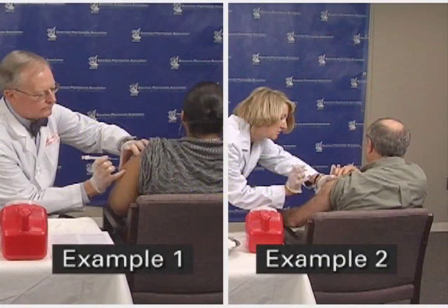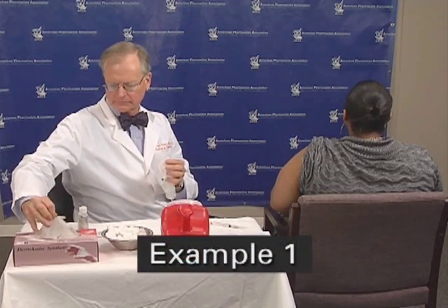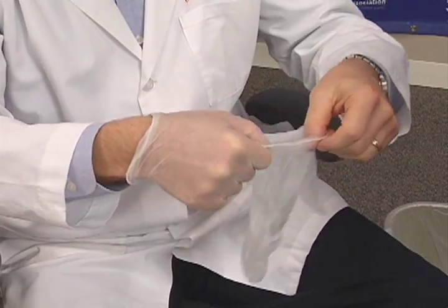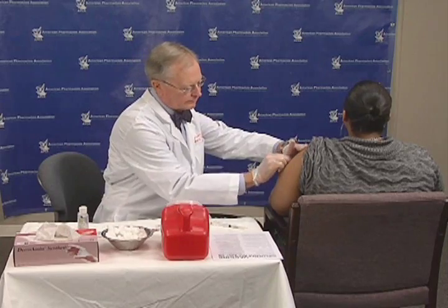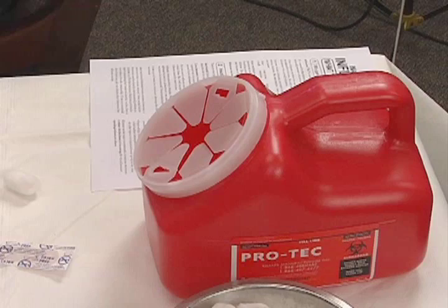There are multiple ways to provide an intramuscular injection; we will demonstrate a couple. Once you are ready to inject the vaccine, although gloves are not required, it may be prudent to use gloves for your protection and patient perceptions — follow your local standards. Be sure your patient is sitting. Expose the injection site, which is the thickest and central portion of the deltoid muscle. Swab the injection site with alcohol and allow the alcohol to dry. Note that the sharps container is readily accessible.